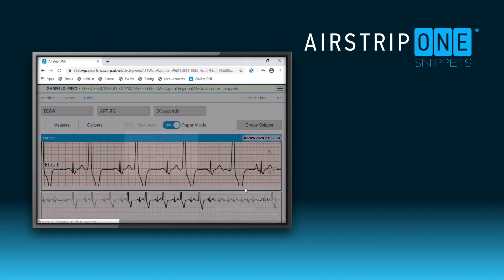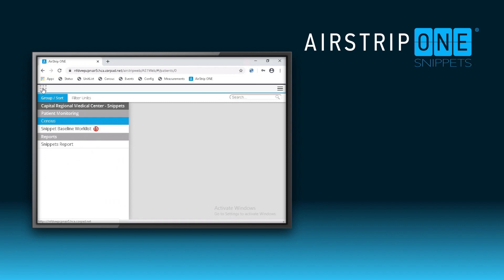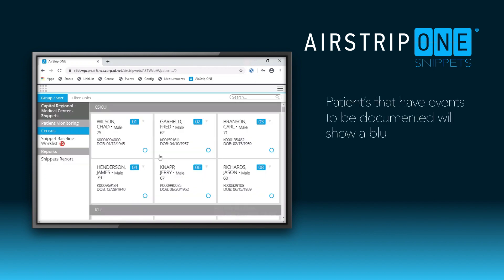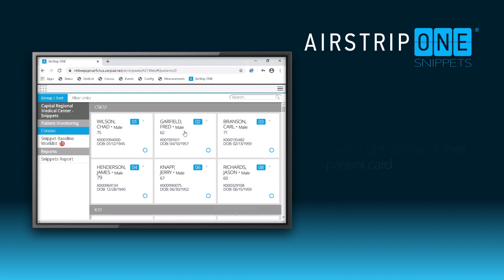As a nurse, if I wanted to document that event, I would go back to the menu and find my patient. The open circle indicates that a document needs to be approved. Select the patient, and on the patient summary screen, select the documents tab.